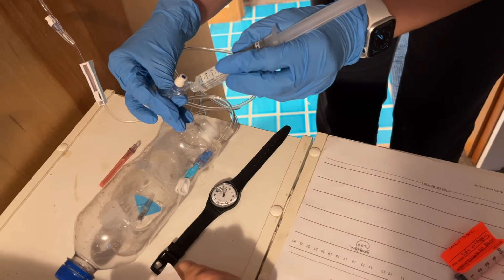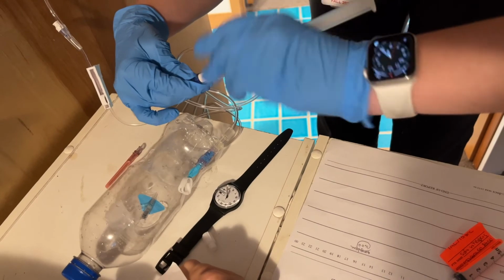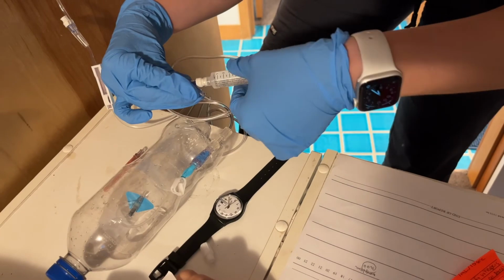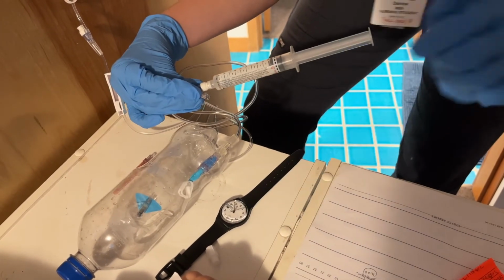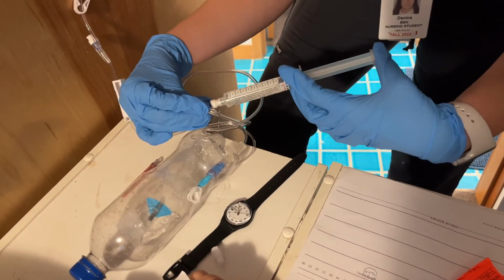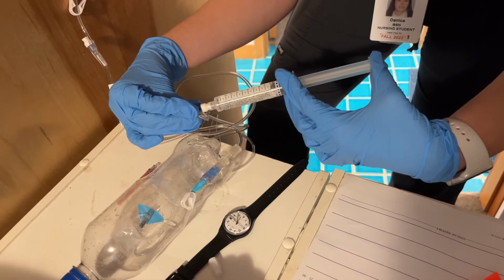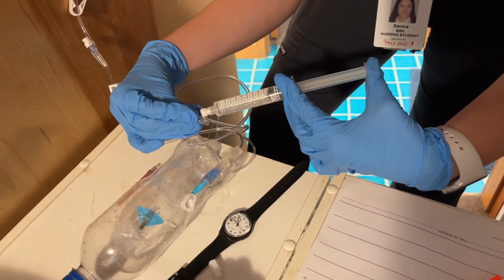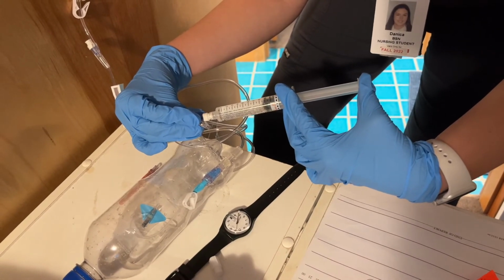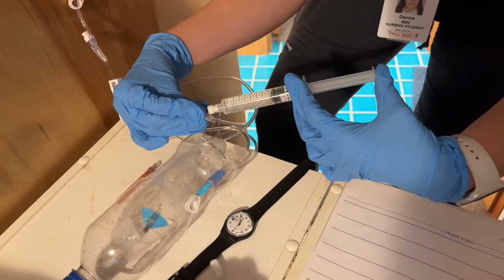So I'm going to put the flush in there. And with the flush, we're going to do 4 mLs in 1 minute. So I'm just going to wait until I see it hit the 45 and then start. So I'm going to start now. 1 ml. And stop and wait. Then I do the other ml.